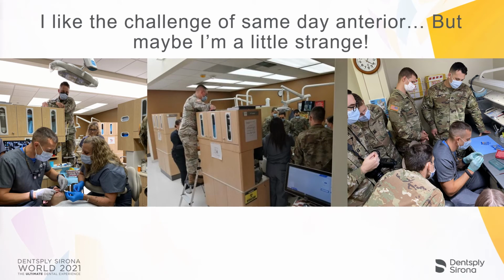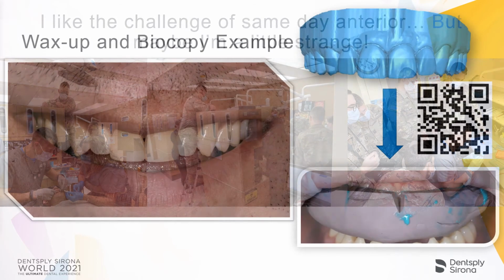So I joke that I like the challenge of same-day anterior, but maybe I'm a little strange, right? So here's one of my typical hands-on courses that I run, and you can see we've got a live patient. I like the idea of having a lot of people gathered around or huddled around like an old school medical professor, because I feel like this is how we can truly pass knowledge. So I'm going to try to bring that into the rest of this presentation, with you in the room and you watching online, to pull you into my operatory and show you what I would do up close.